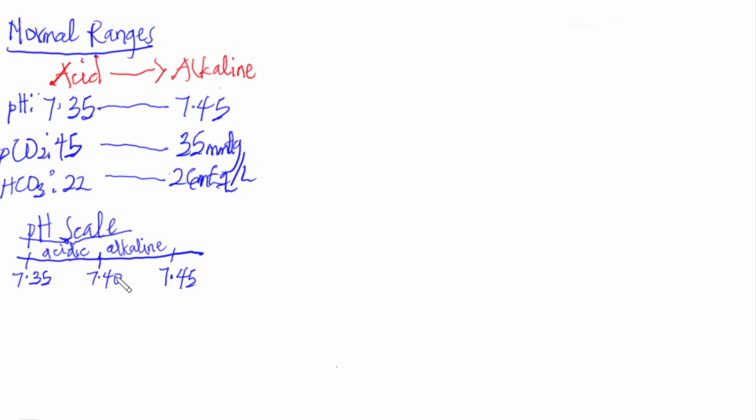But even if it's between 7.35 and 7.45, and it is more than 7.40, which is the absolute, it is also termed to be on the alkaline side, just that it is still normal. You need that in defining what is fully compensated and so on. We'll get to that, but for now, let's look at the normal ranges. So that's for the pH.